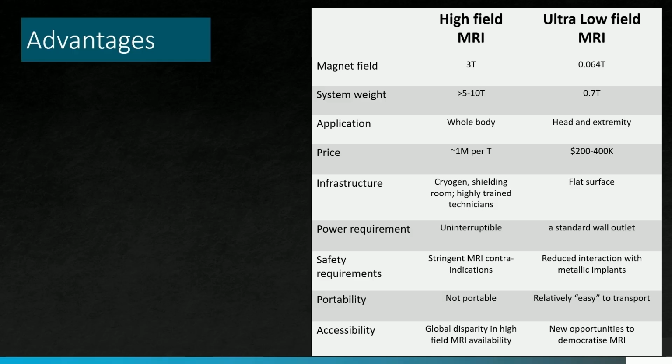While recent ultra-low field MRI studies, especially in the emergency department, have shown reduced interaction with metallic implants. And as you can imagine, in terms of portability, high field is of course not portable at all. They say ultra-low field MRI is portable, but I want to highlight, I would put it in quotes as well, that it's relatively easy to transport.